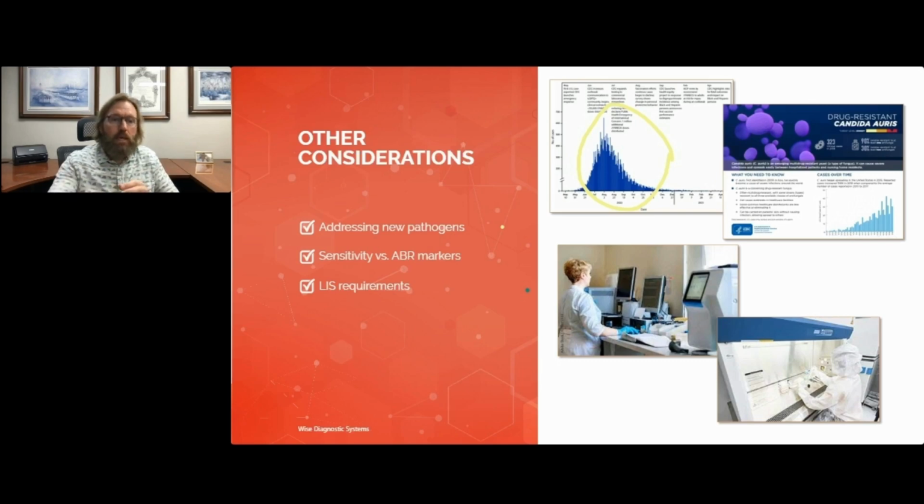We didn't jump right into trying to bring it on board because it was the newest thing. Now, that being said, the diagram here on the top right, and I really focus on the graphs of it, something that we see, especially here in the state of Texas, we started seeing these CDC warnings about Candida auris rearing its ugly head. And what we watched is over time, it has grown and grown and grown to be a more prominent pathogen, especially in the markets we serve, especially here in Texas.